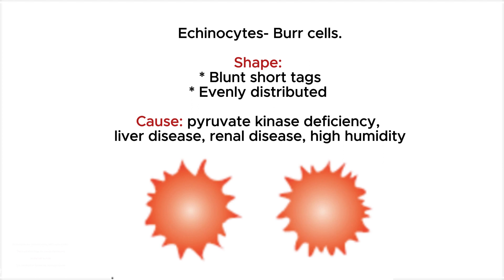Echinocytes are normochromic with normal color. The blunt, short tags are evenly distributed on the cell surface. This condition is caused by pyruvate kinase deficiency, liver disease, renal disease, or high humidity which makes the smear dry slowly.